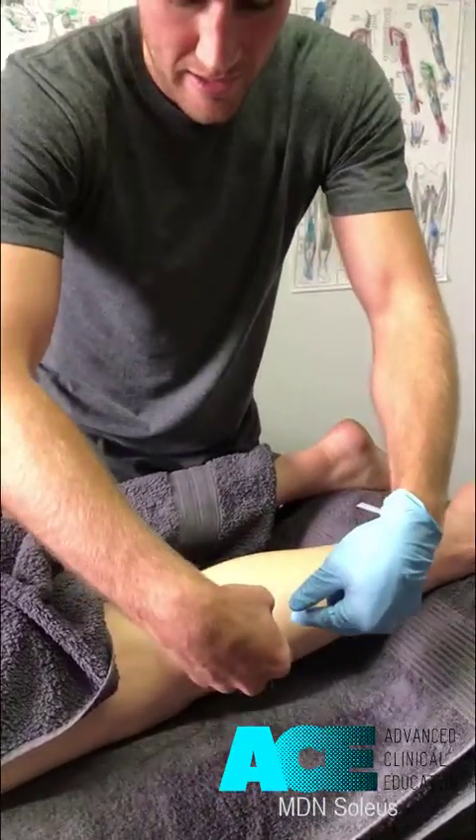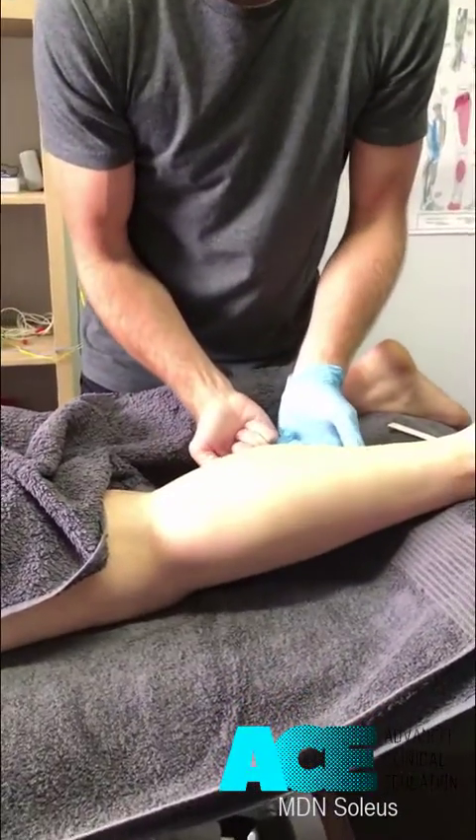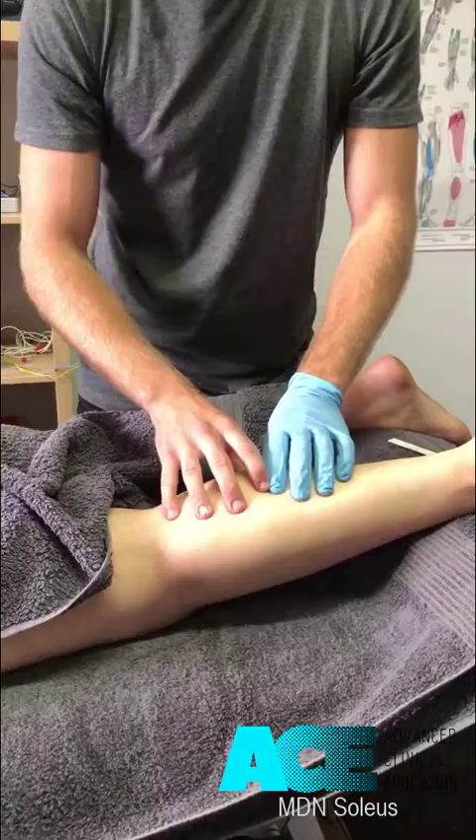If we come in laterally — and we can also come in medially — it keeps us well clear of those structures.